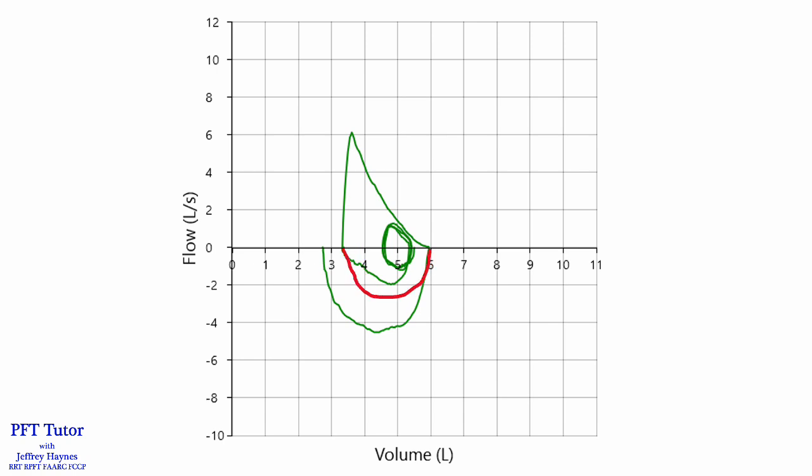You could also have a submaximal inhalation error with a perfectly shaped flow volume loop as shown here. In the red tracing, the inspired loop is not full, but it just so happens to connect with the expiratory loop, giving you the impression that the patient inhaled fully when they really didn't.